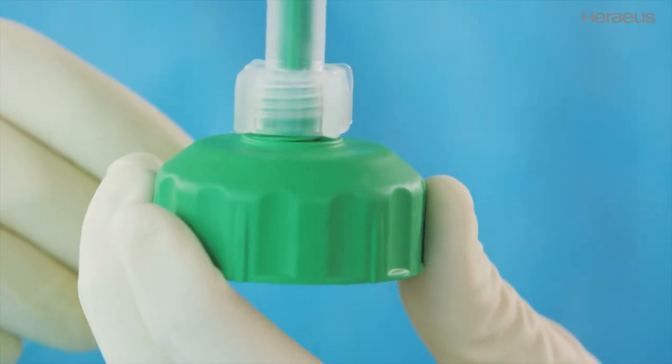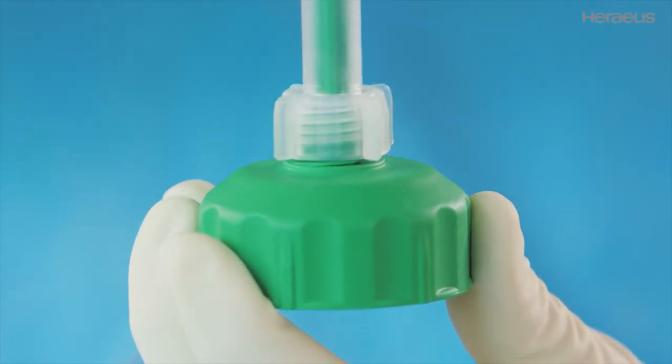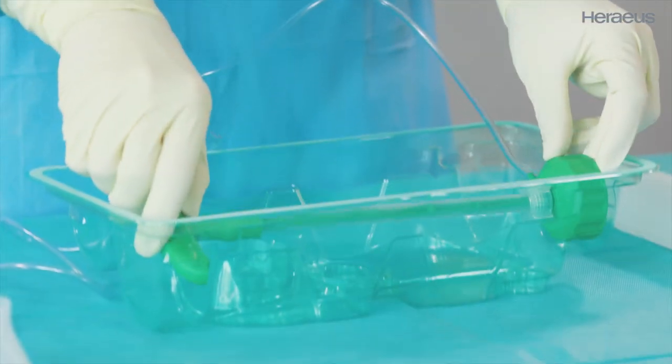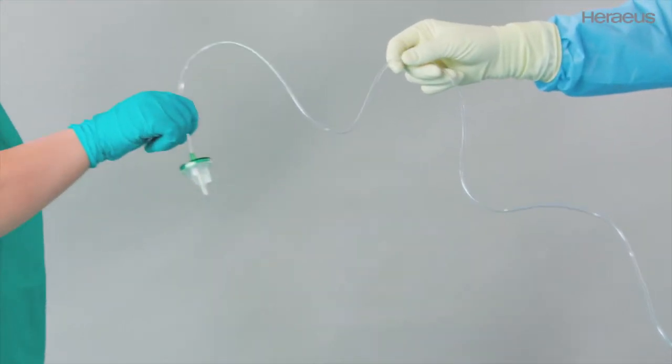Palomix is supplied with the locking screw opened. This setting must not be changed for the mixing process. Place the mixing rod back in the tray, then connect the vacuum hose to the vacuum pump.